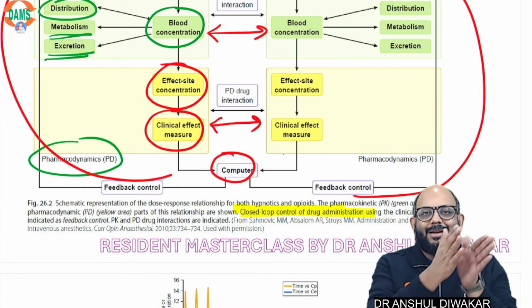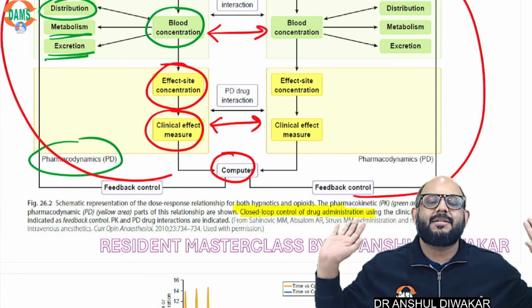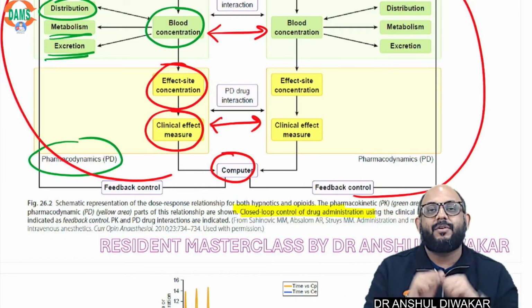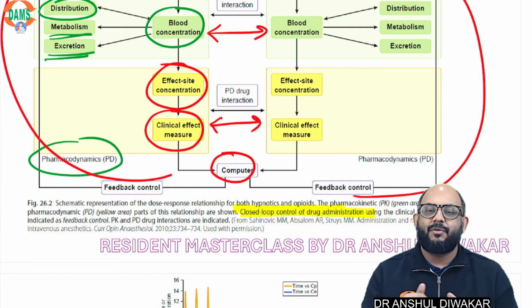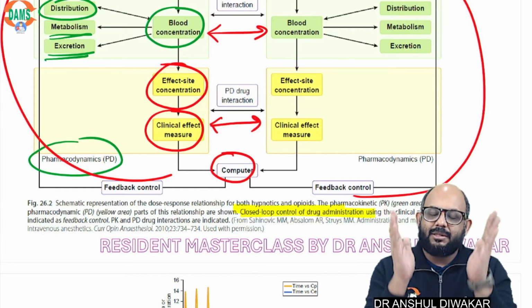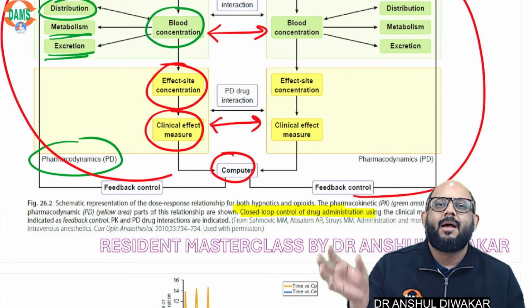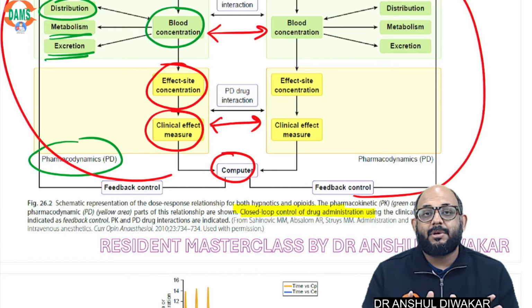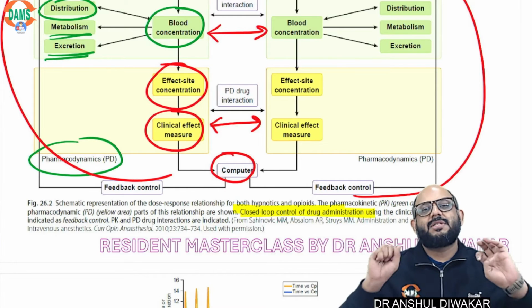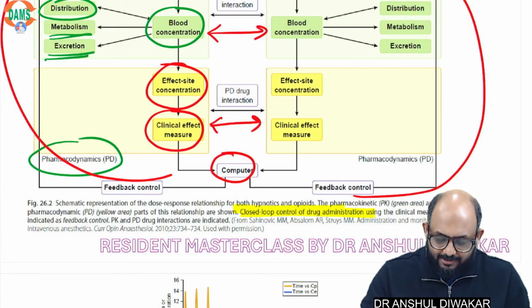In TCI, the Target Controlled Infusion System, all of this has been automated and given to the computer. And that is our ideal way of giving TIVA, where we don't have to do anything. We just put in the patient details. Everything has been pre-calculated according to a lot of algorithmic scales and all the pharmacokinetic and pharmacodynamic data that we have collected over a large sample size. And then we just sit back and relax. That is your ideal TIVA with TCI.